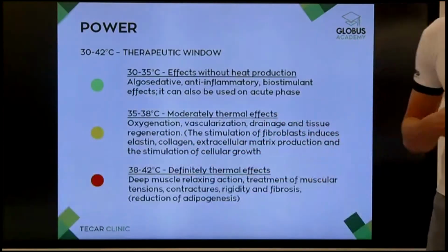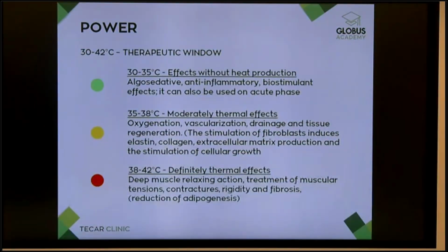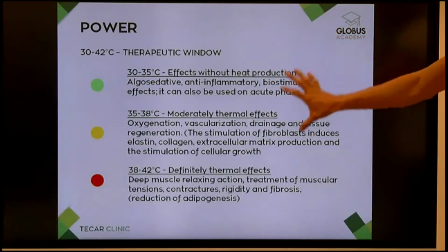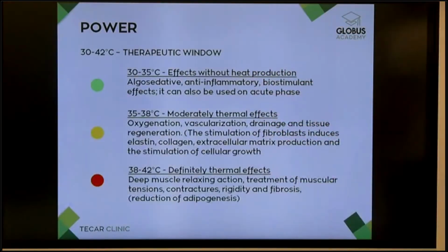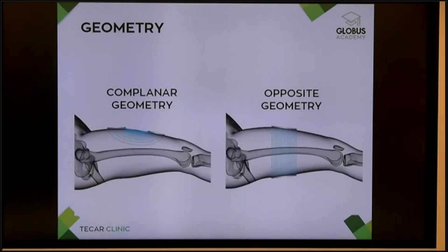And then we get the hyperthermal window. Also, in the next webinars, we're going to have other specialists from different countries that are going to show us different applications of the same therapeutic window. So stay connected with the Globus webinar, because I think we have a lot of news for you in the next days. So this is the power window, the first variable.